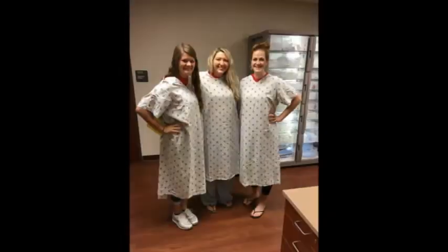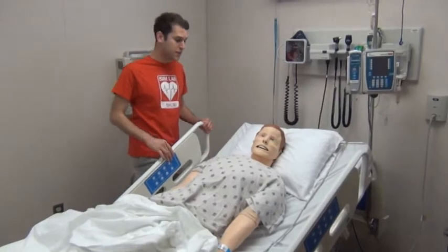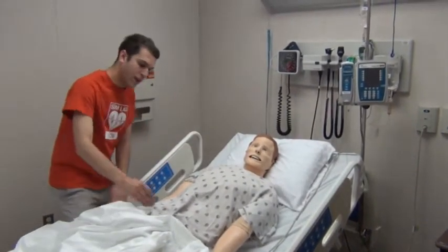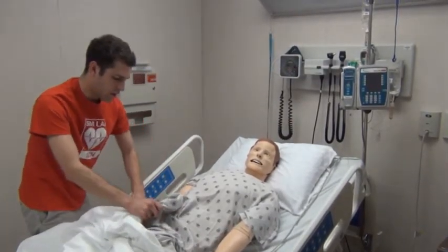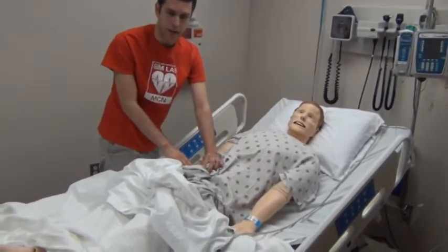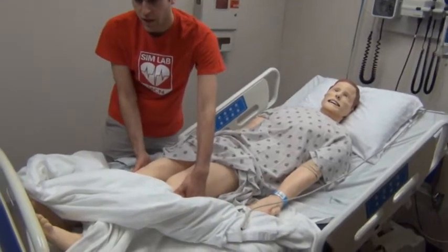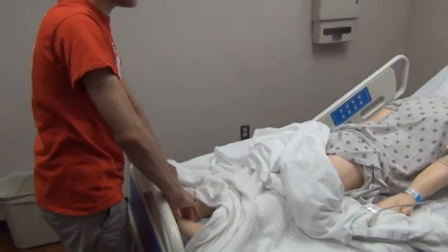During your simulation day, you will be interacting with high-fidelity mannequins like this one, or standardized patients, which are real people. You will be noting on the high-fidelity mannequins, assessing any carotid pulses, radial pulses, femoral pulses in the groin, popliteal pulses underneath the knees, as well as pedal pulses.